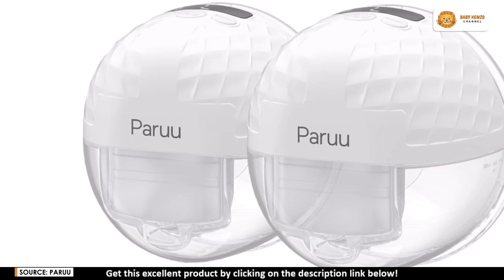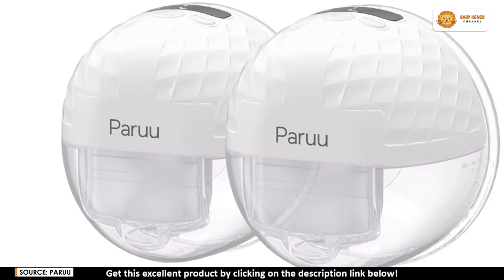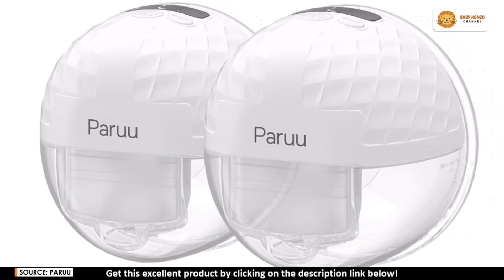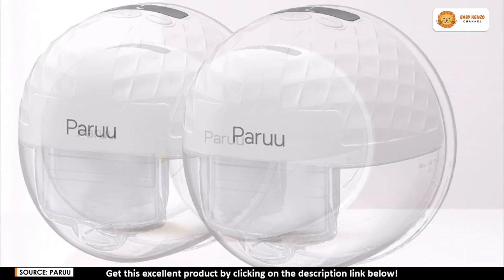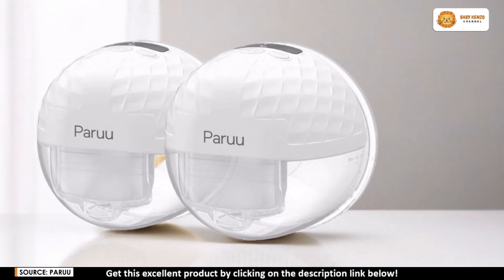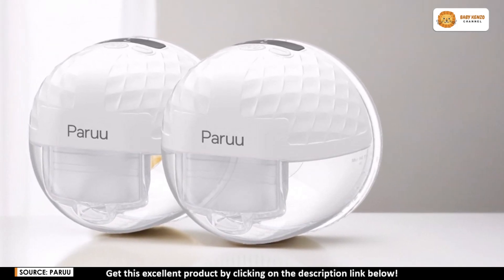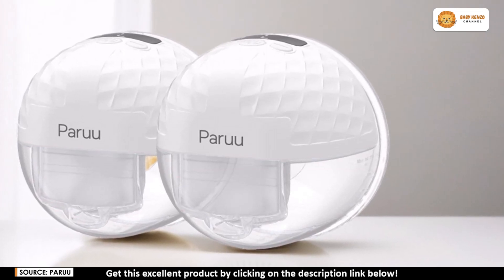For all the multitasking moms, meet the Paruu P10 hands-free breast pump — the perfect companion to make breastfeeding simpler and more comfortable. Whether on the go or just needing a little extra freedom, this wearable pump is designed to fit discreetly under your bra while delivering strong hospital-grade suction to maximize milk output. With the Paruu P10, moms can enjoy a lightweight, powerful, and easy-to-use pump that makes expressing milk feel effortless and natural.